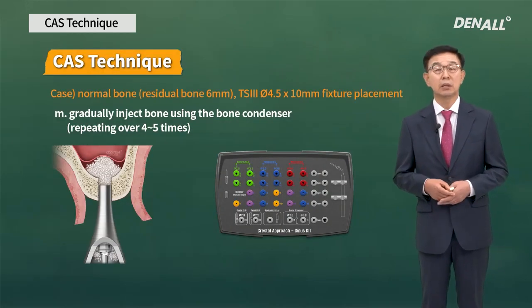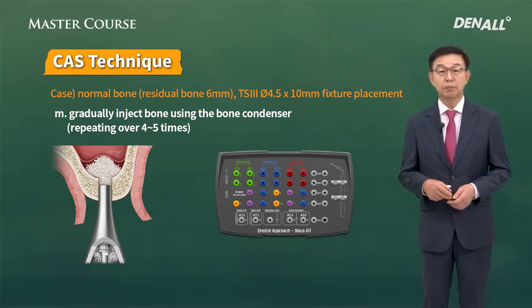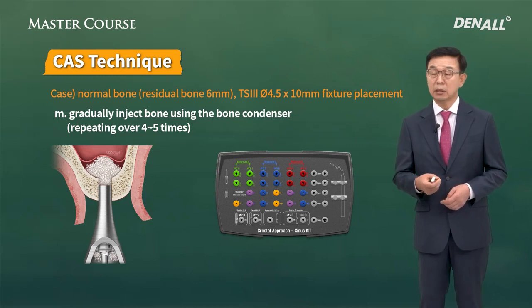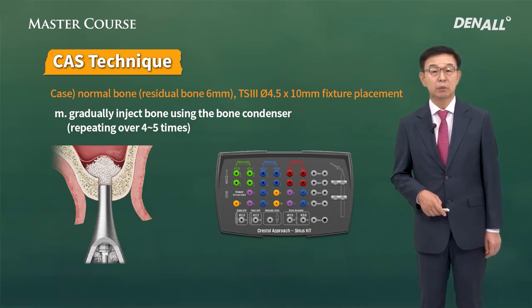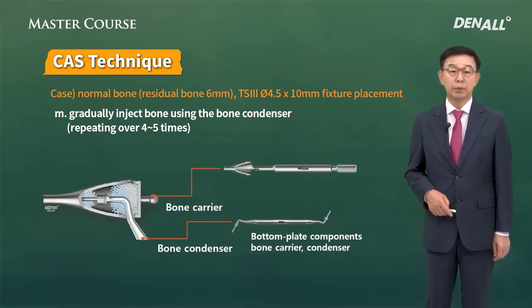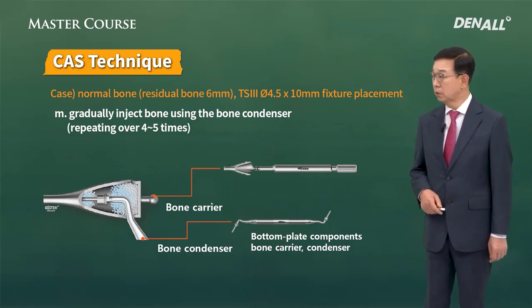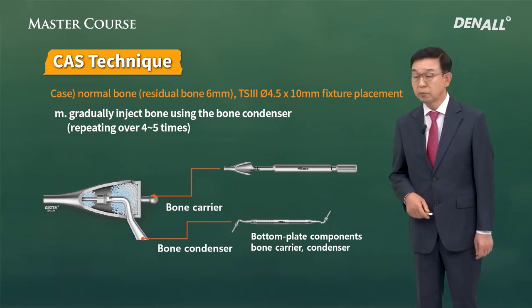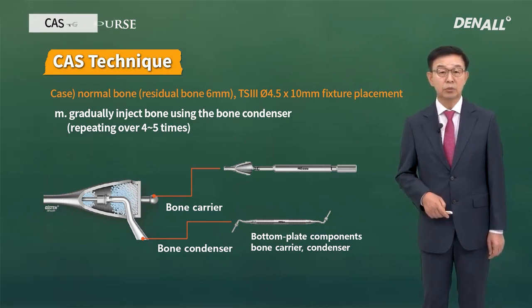Finally, always pull to remove the saline in the sinus. You need to do it fully. Bone graft should be done and the implant should be placed. In doing bone graft, there are tools for bone graft. There's also syringe type bone, and using that you can do it quite simply.